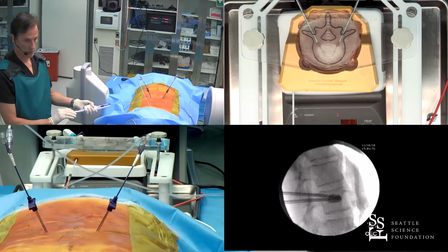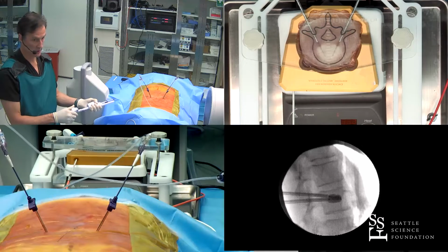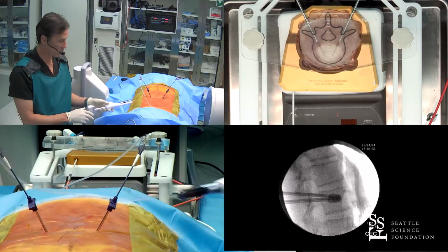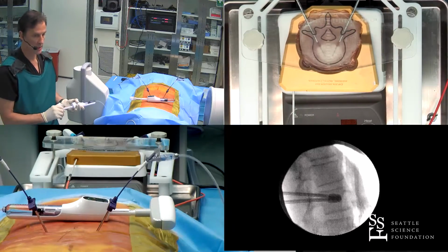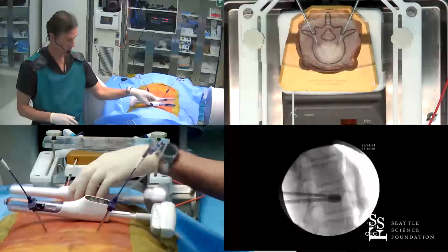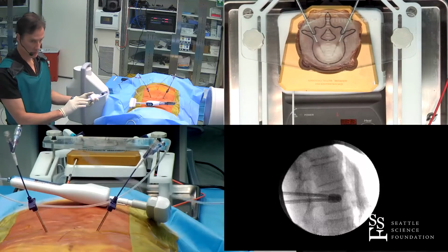And for our audience, Doug, how high do you go? So functionally, I don't mind the pressure or the volume. I do it all by position within the vertebral body and height reduction. For this, because it's a tumor ablation case, we want to get the cement in the center portion of the vertebral body, endplate to endplate.